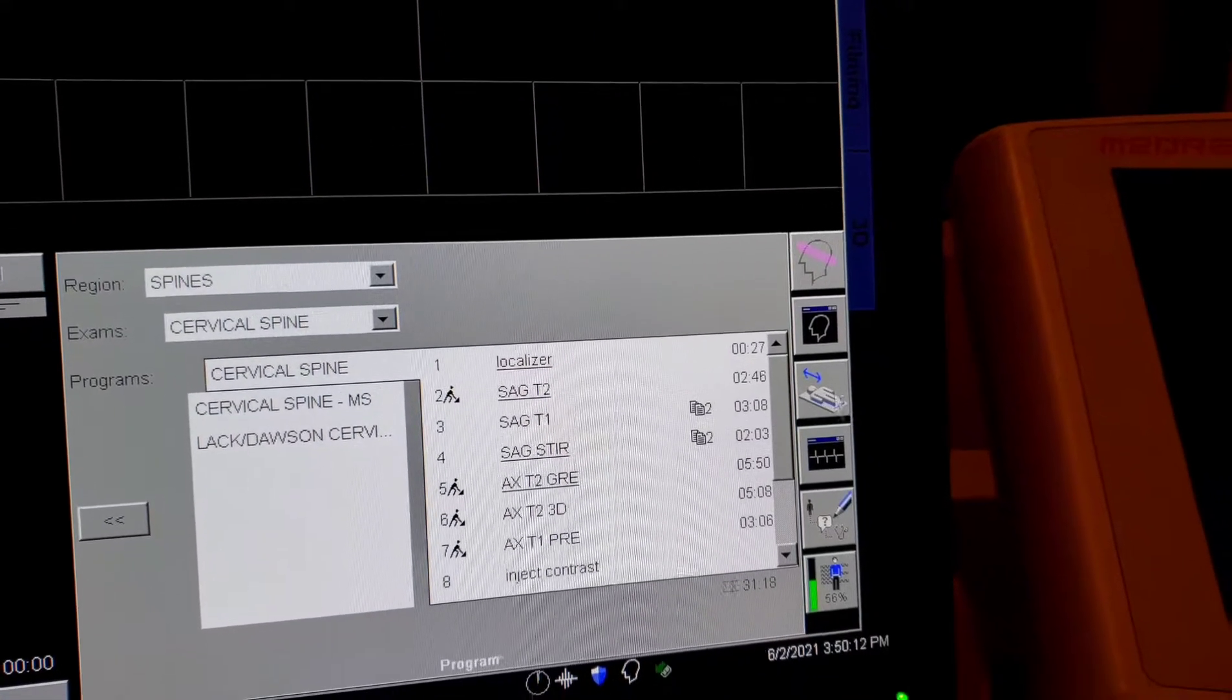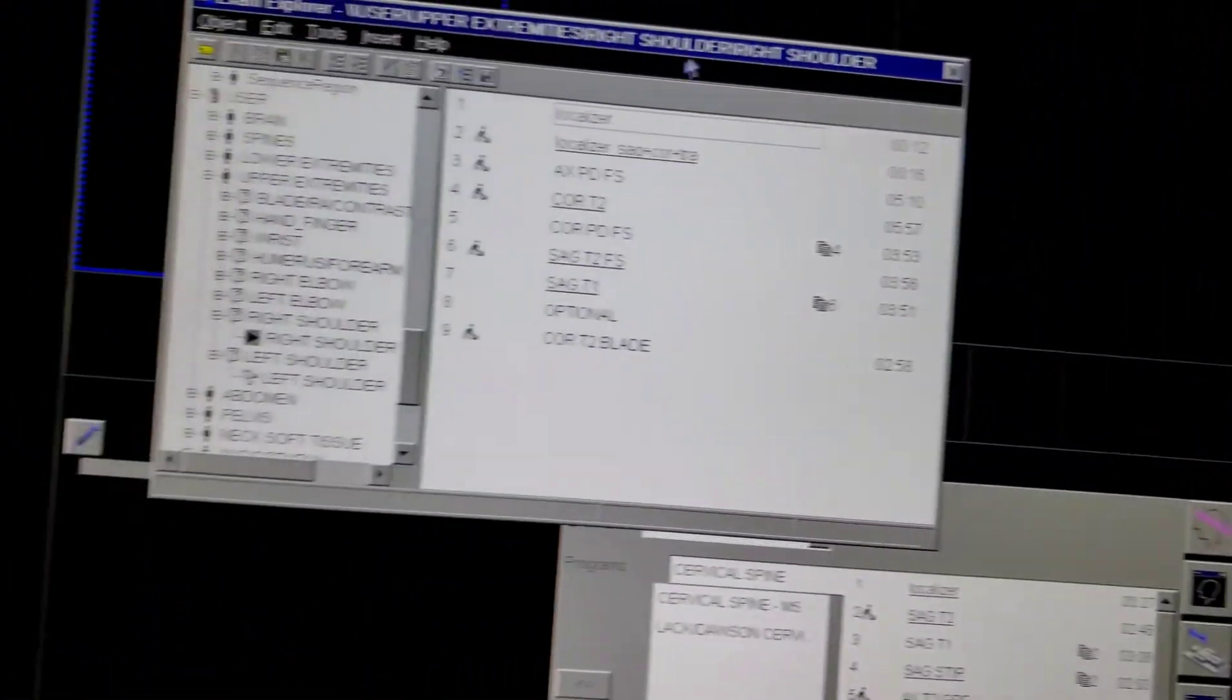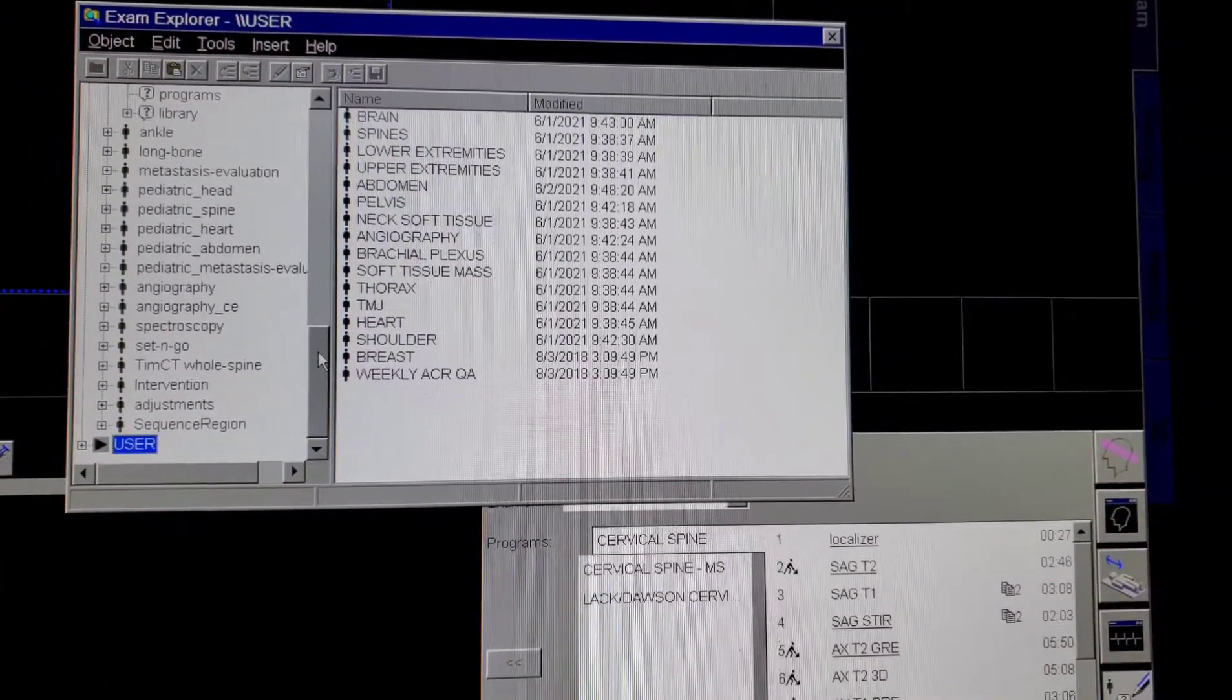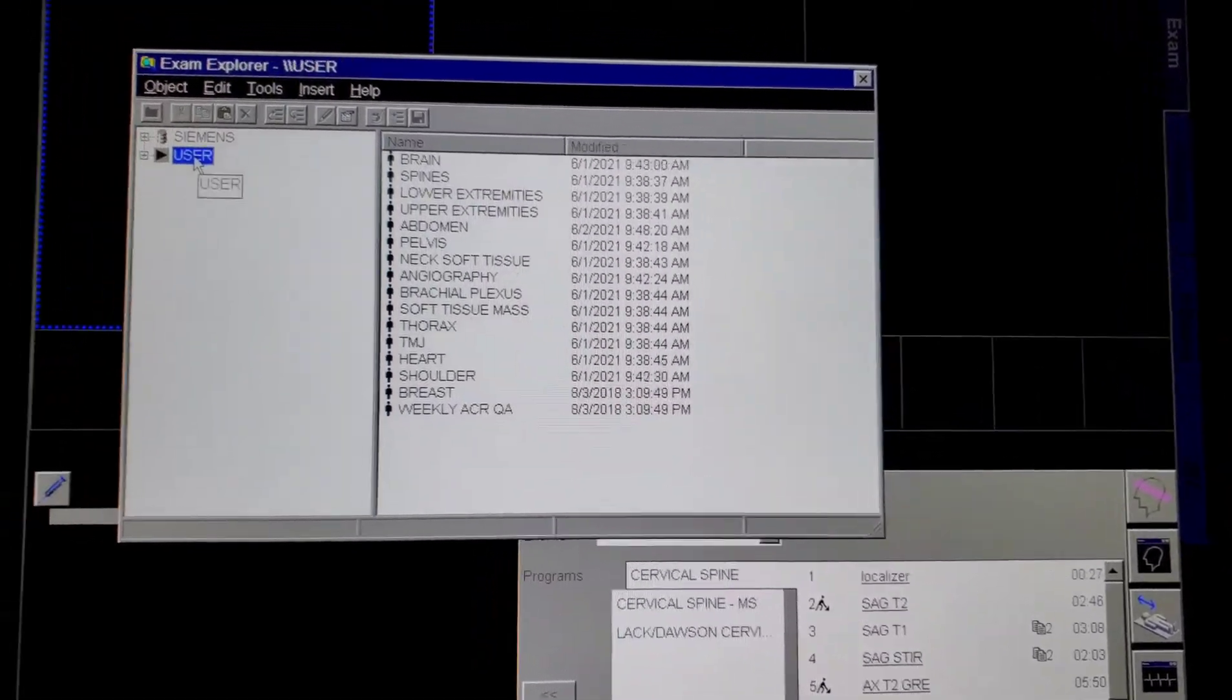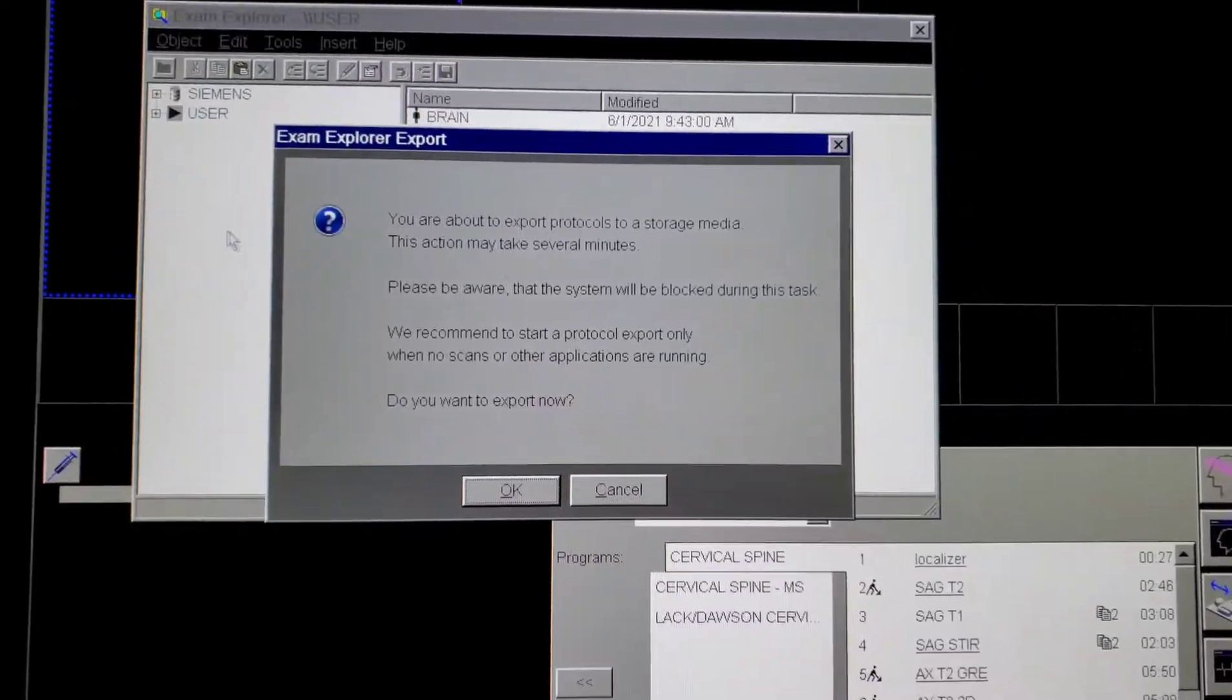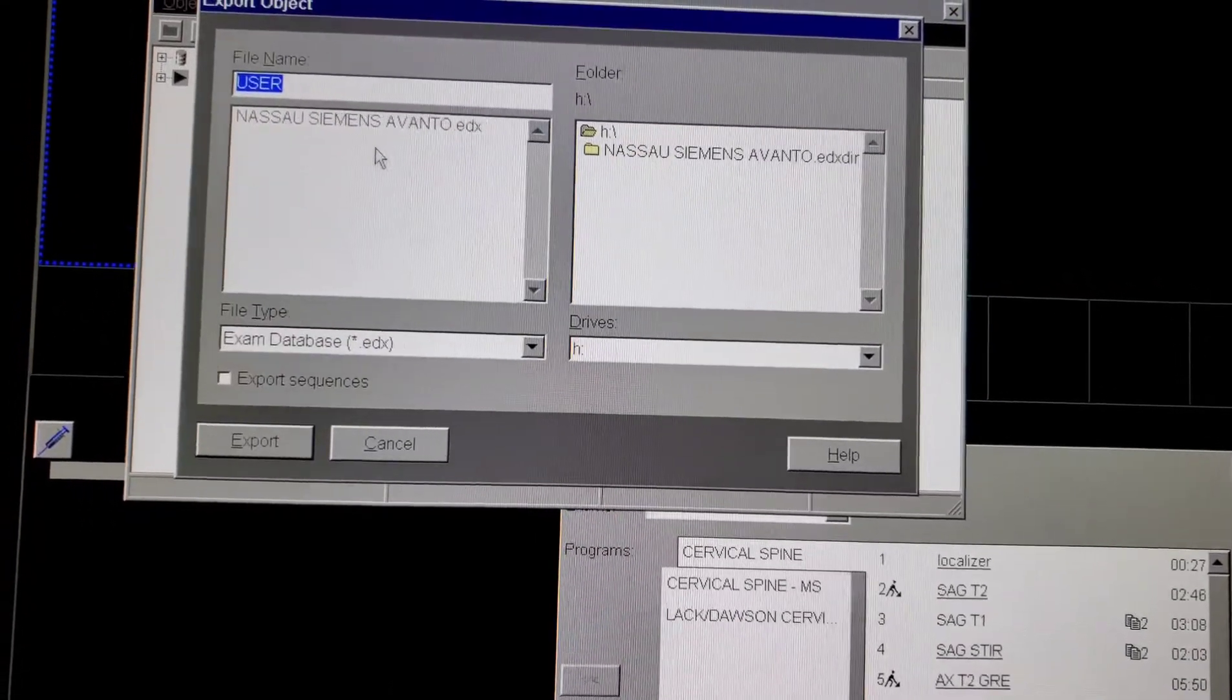Alright, we're about to export the study here. Just want to show you how really quick. I like to make everything simple. Click on the user, go to object, go to export, and then click okay.